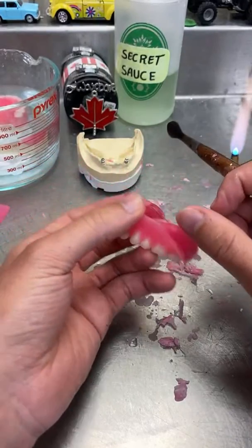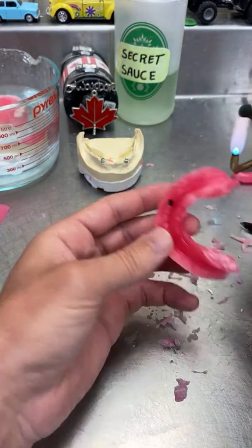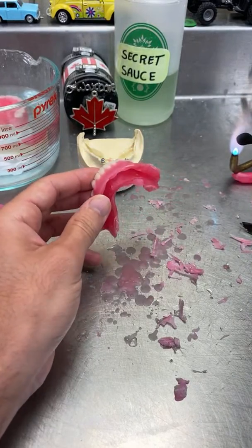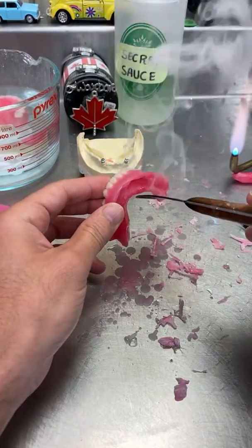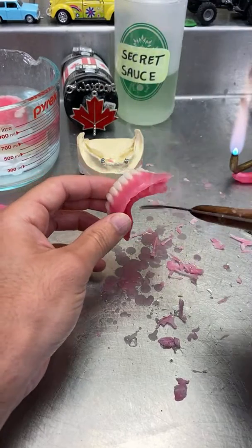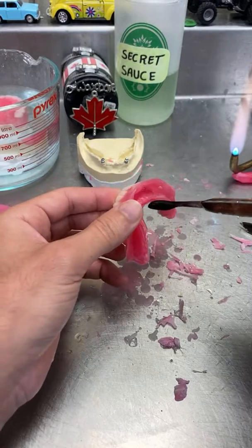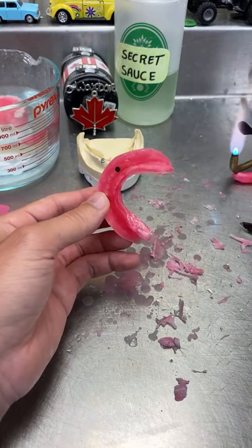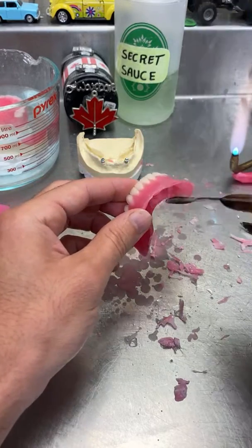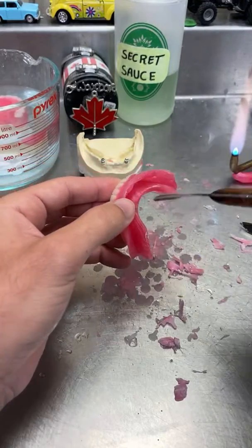So basically I'll be just following where the base plate was. I don't care about all these because that's just the extra wax that fell down or melted down and ran through those tight areas there. You want to make it a little thick when it's in wax because distortion can still happen. So leave the wax work a little bit thick, but when finishing make it thin.